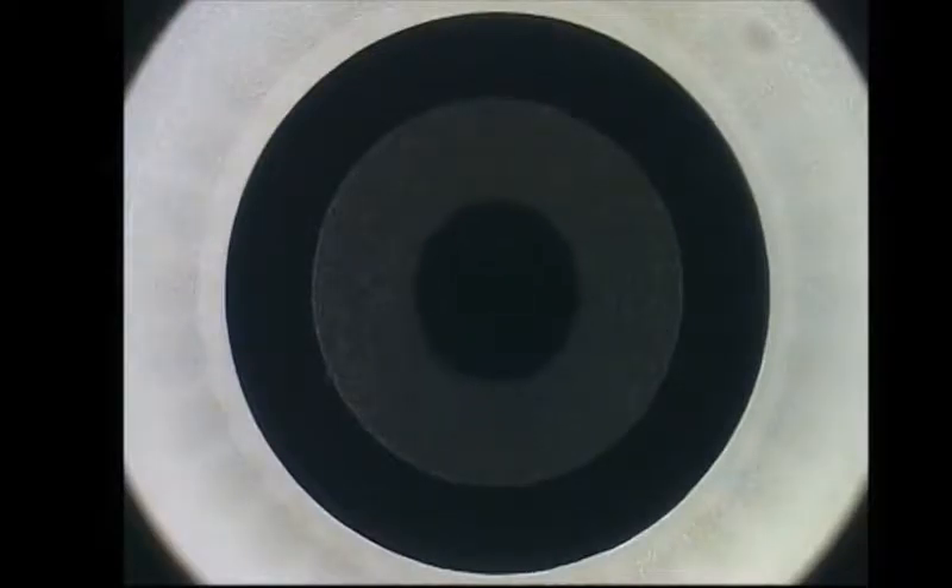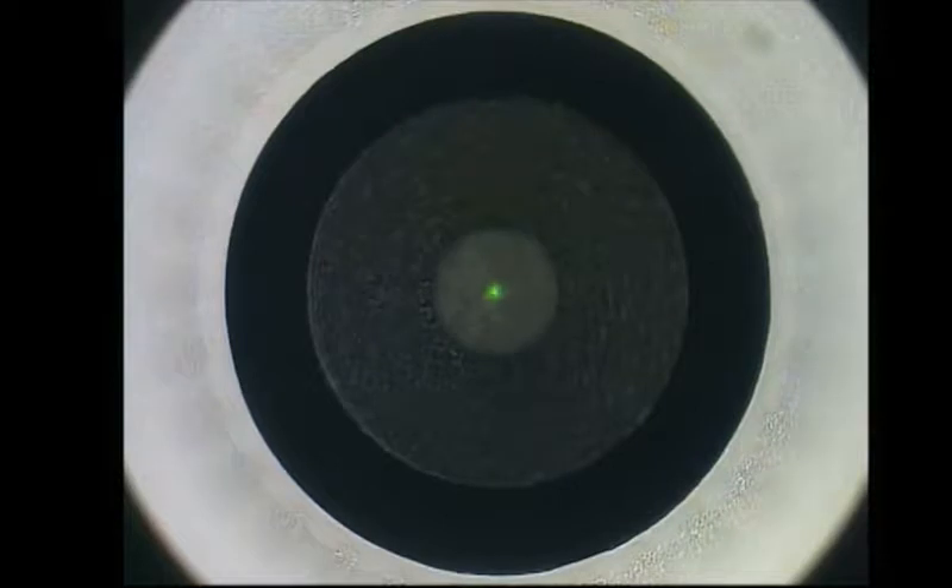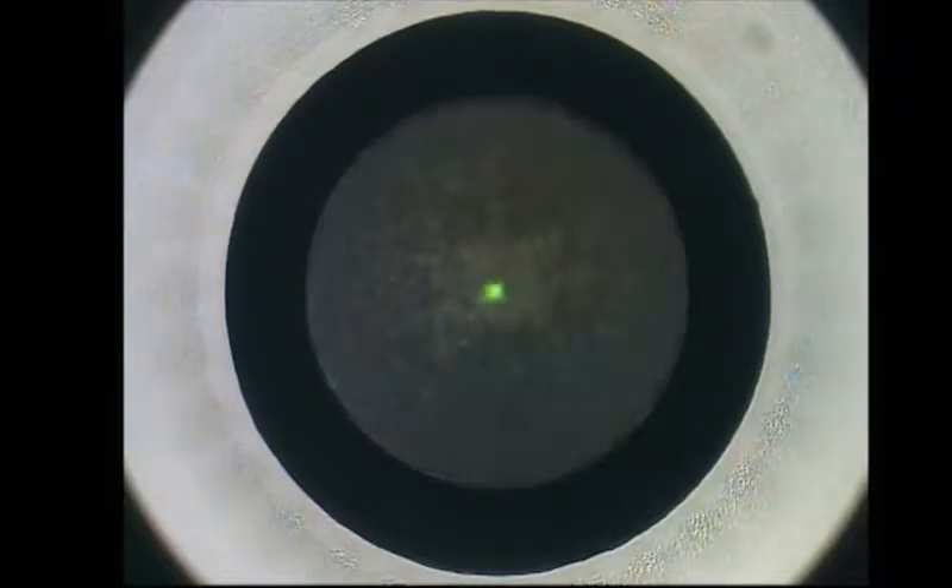The lower interface of the intrastromal lenticule is created first, followed by the side cut and then the upper interface known as the cap. Following this, through the 2mm incision created by the laser, the anterior surface is dissected first, followed by the posterior surface, and finally the lenticule is extracted.